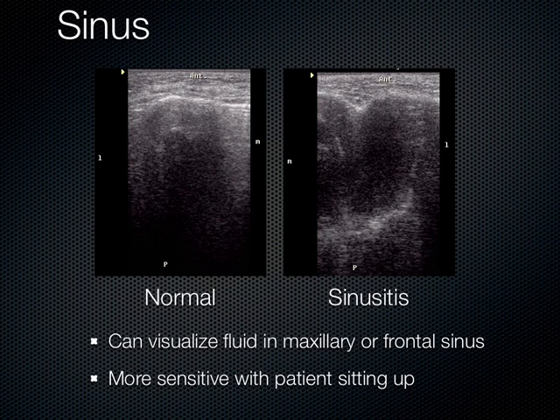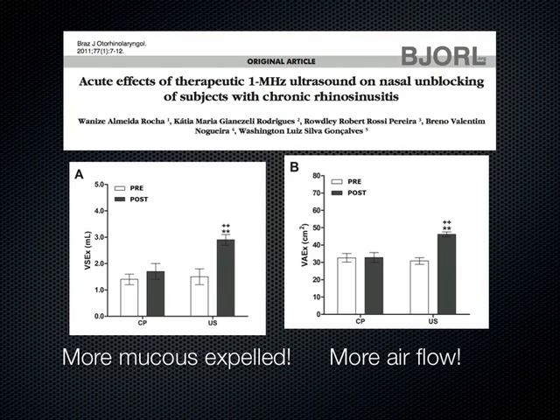It's easier to do this when the patient's sitting up. And actually, there are some therapeutic effects of low-frequency ultrasound on nasal unblocking in patients who have chronic sinusitis. With ultrasound, there's more mucus being expelled and also more airflow after the patient gets ultrasound of their sinus. So I don't know how accurate this is.